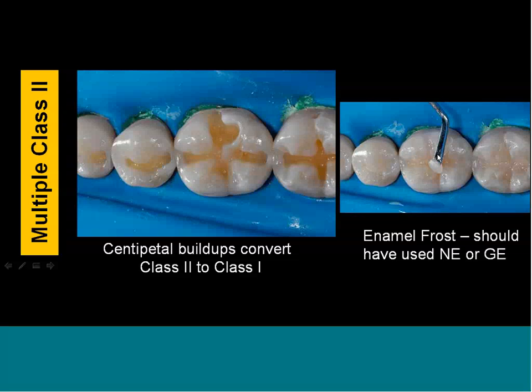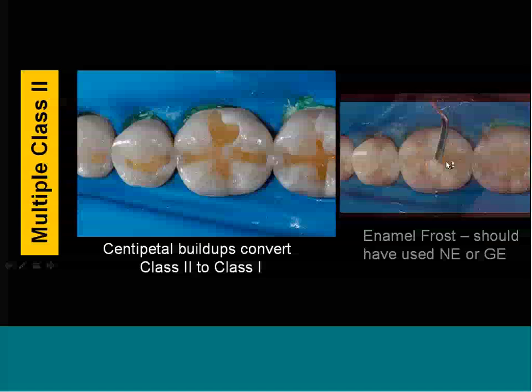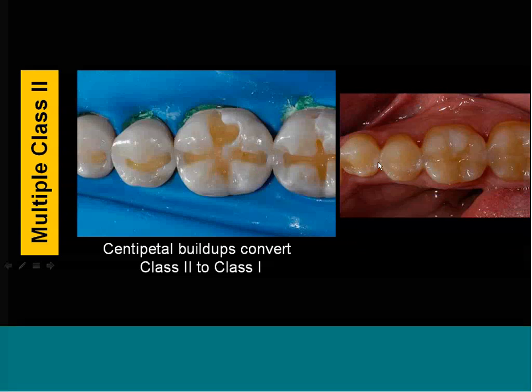So I chose too light of an enamel shade here. I picked the frost, and I should have used either the neutral or the gray. It holds true in anteriors and in posteriors as well. So when you're done, typically I'm telling the patient, okay, your fillings, your composite, your restoration is a little darker, and tomorrow they'll look great. Today looks good, but tomorrow looks great. In this case, they looked great when I got done. That meant they're a little too light. So when we take these off, you'll see the composite's just a little too light.